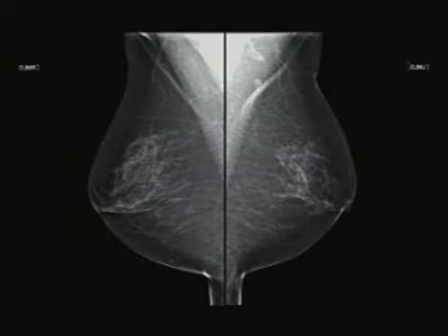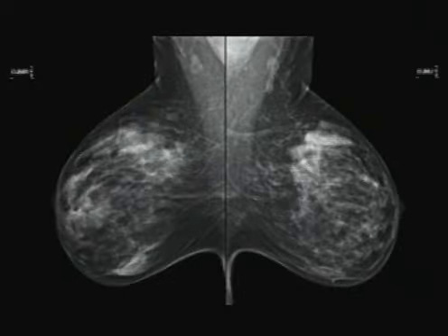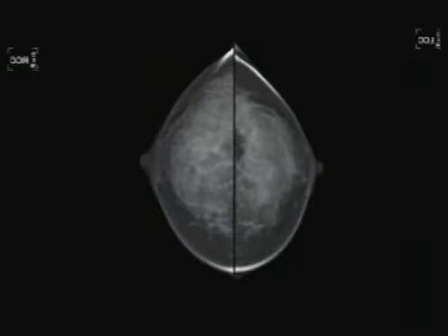In both the fatty breast, and these are digitally acquired images, the heterogeneously dense breast, and the extremely dense breast, all digitally acquired images.